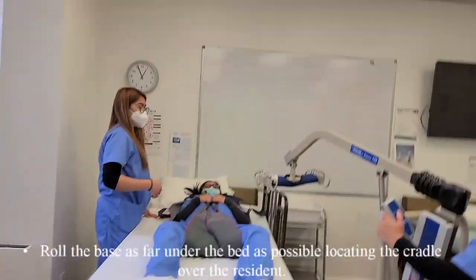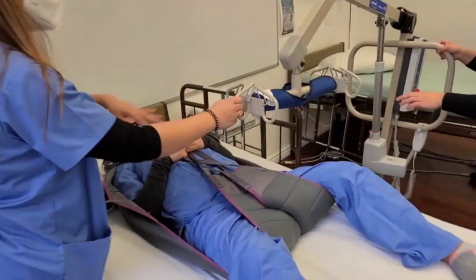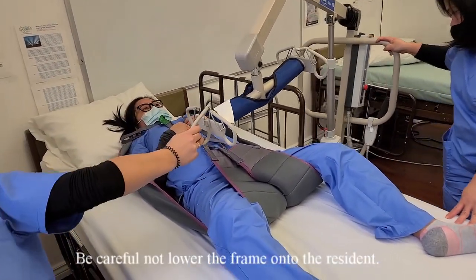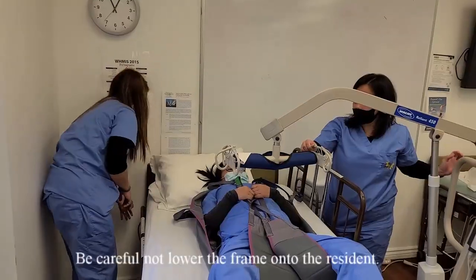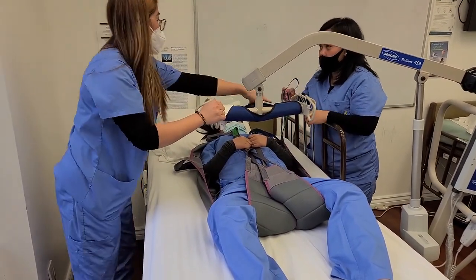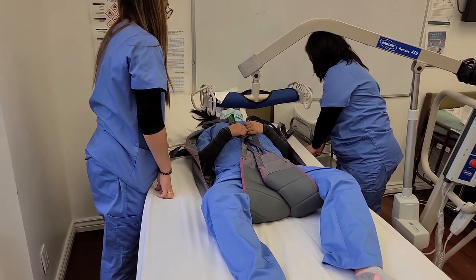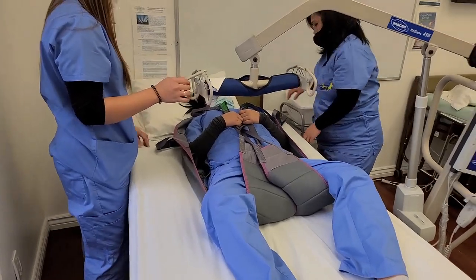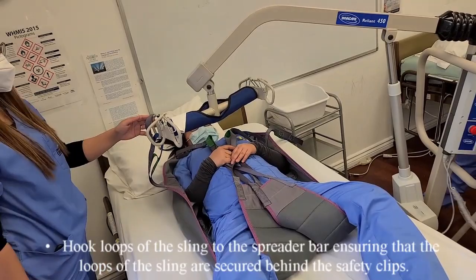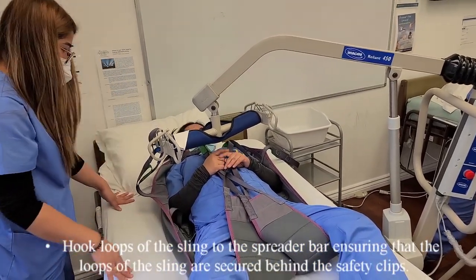Roll the base as far under the bed as possible, locating the cradle over the resident. Be careful not to lower the frame onto the resident. Hook loops of the sling to the spreader bar, ensuring that the loops of the sling are secured behind the safety clips.